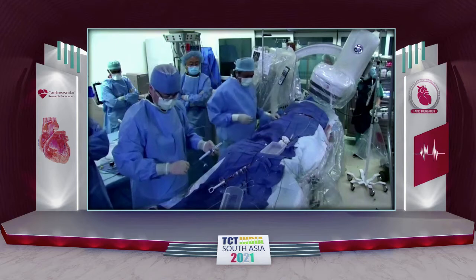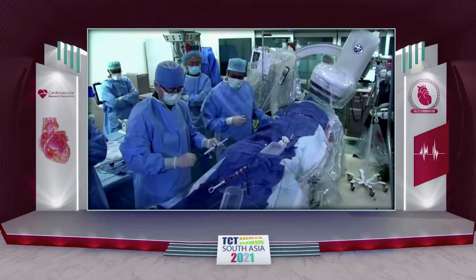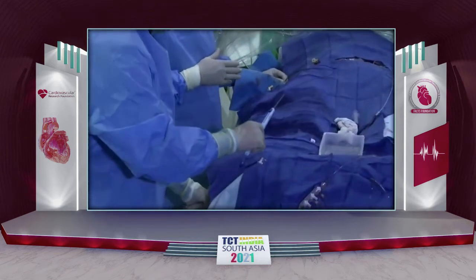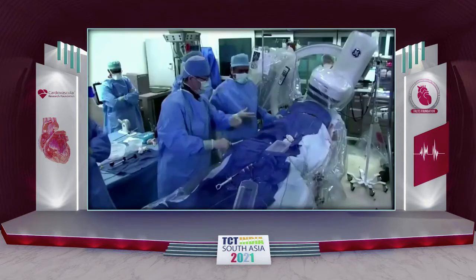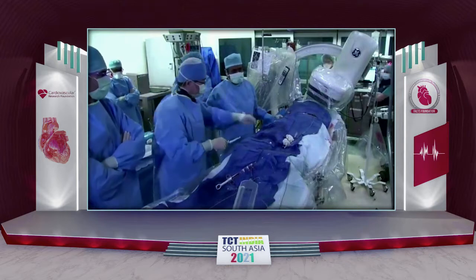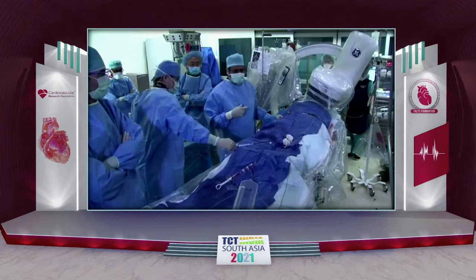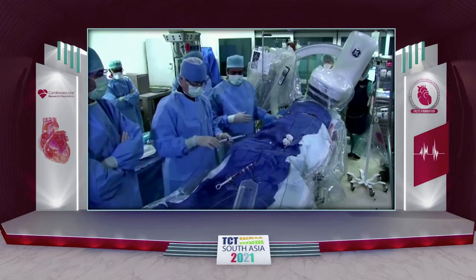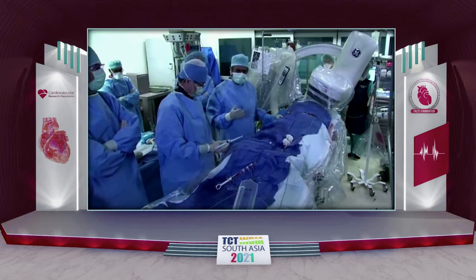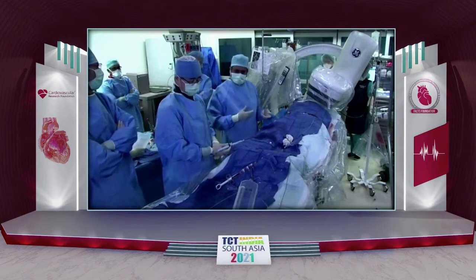So I would say that we are still a center that uses quite a bit of TEE because we've adapted TEE to our use. Our median length of stay is 1 day. Most of these patients go home the next day. In fact, a lot of patients go home the same day. We don't find that using anesthesia and TEE significantly delays things in our setting. And with the volume that we do, when you're doing 700 cases and trying to say this one goes for TEE, this one doesn't, things get a little complex.